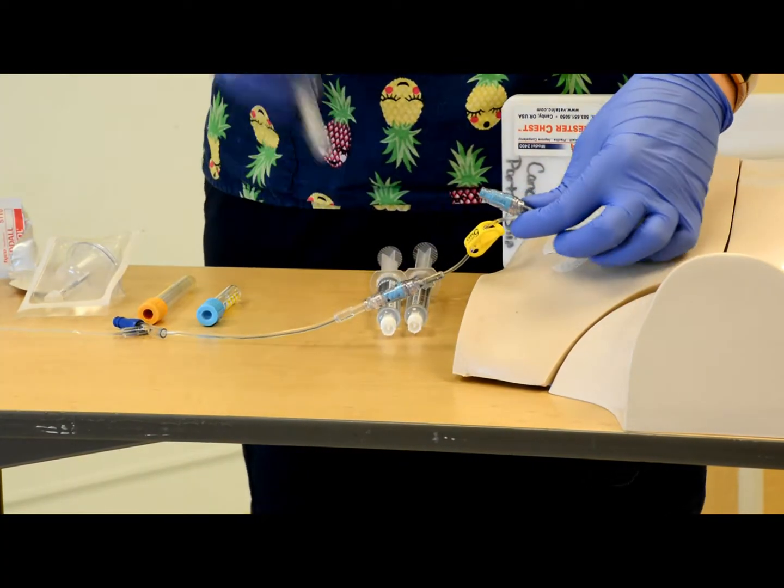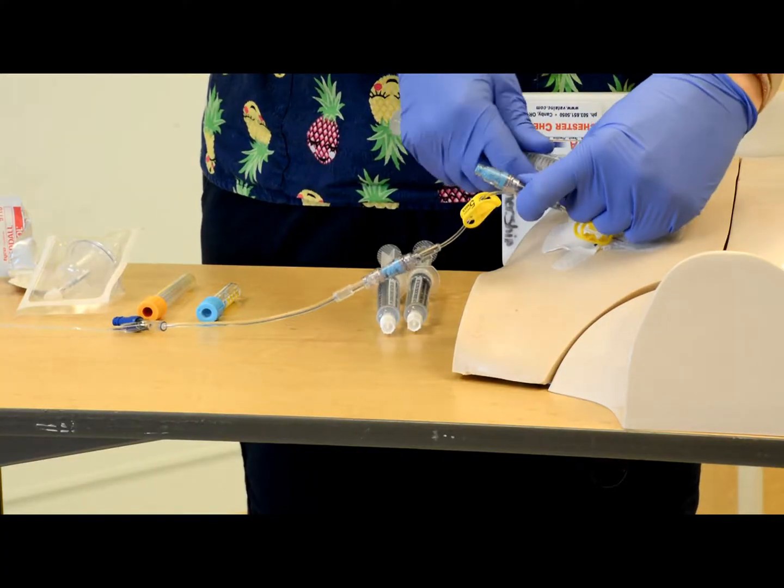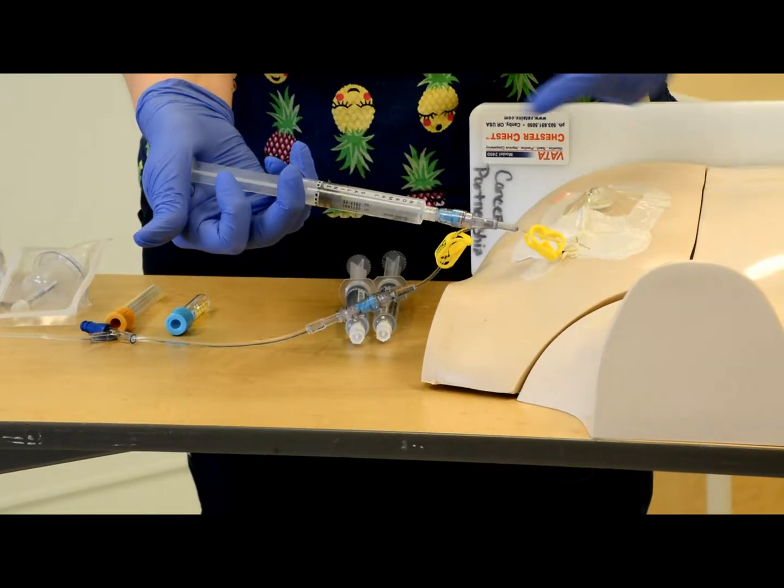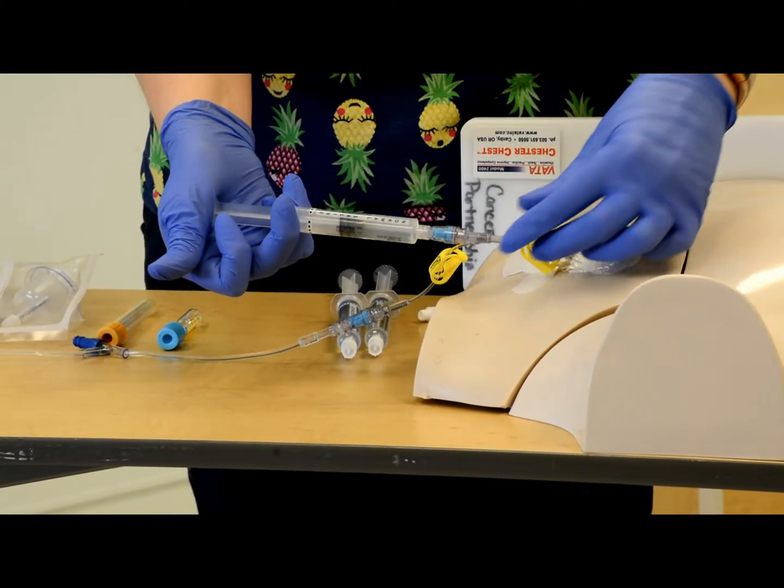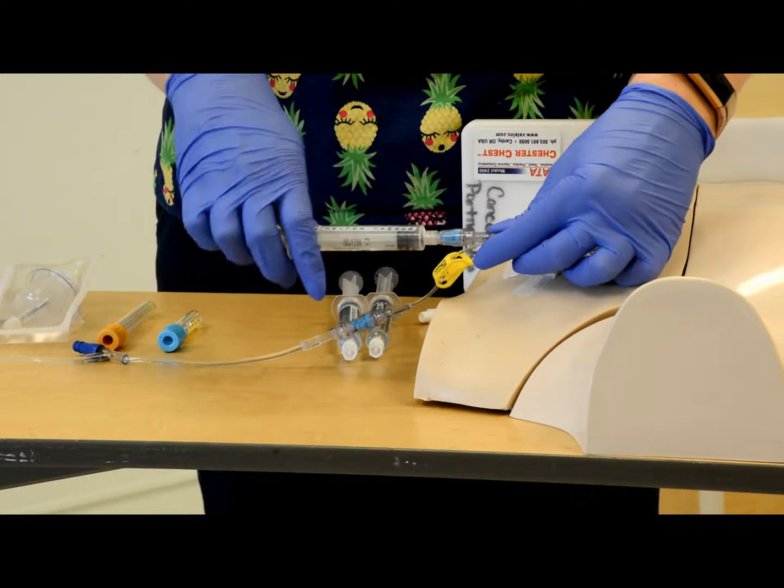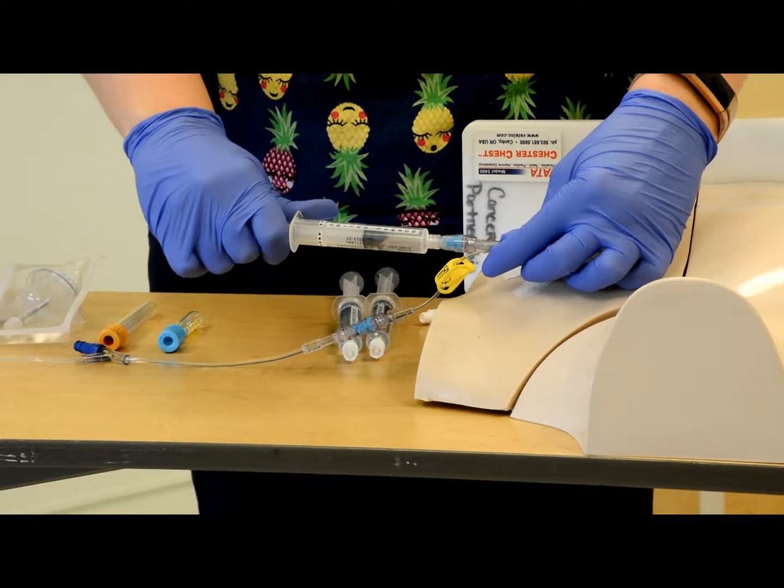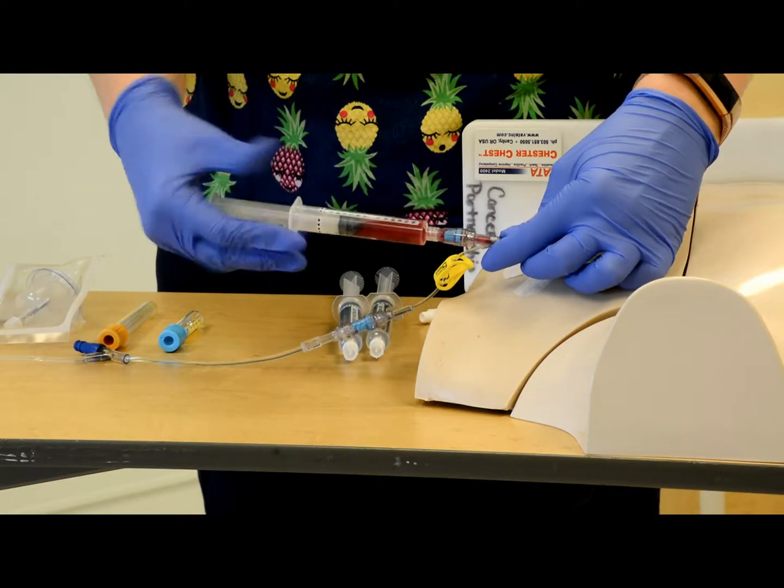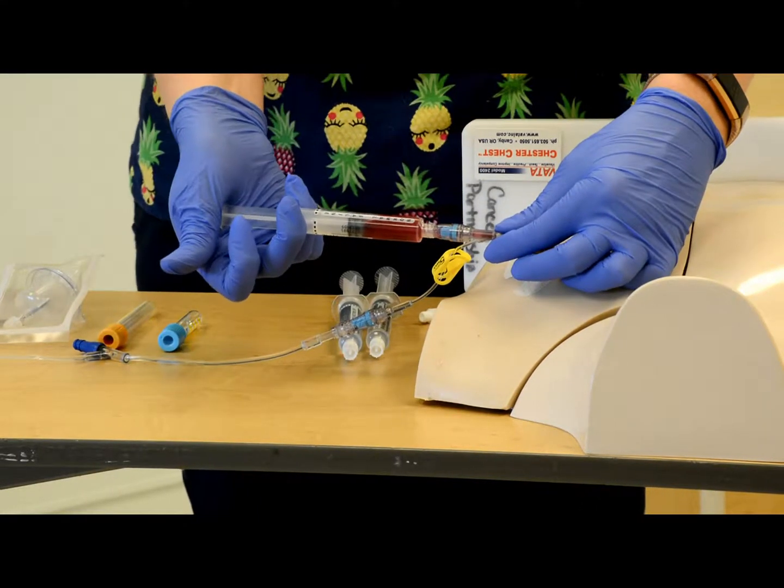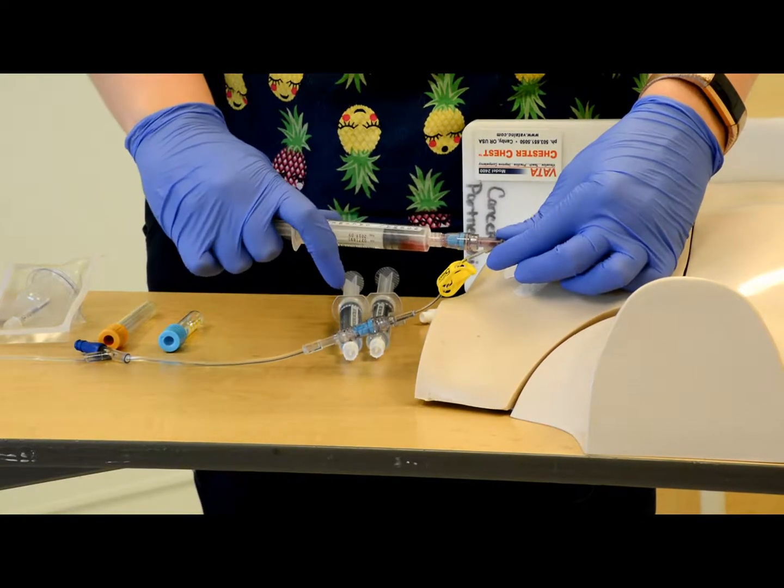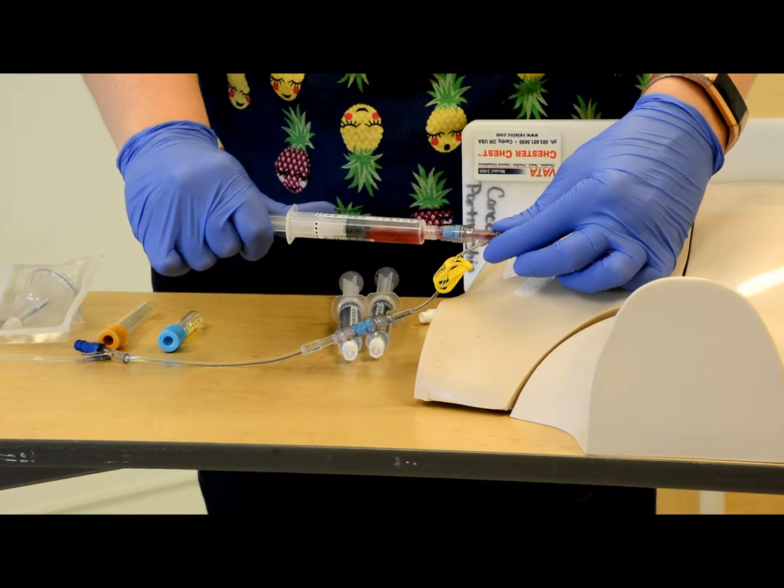Now using one syringe of saline, you're going to flush all 10 mls into the line. And then you're going to pull back and get 4 to 6 mls of blood return. And then in a fluid motion, you're going to push that in again, and pull back 4 to 6 mls.